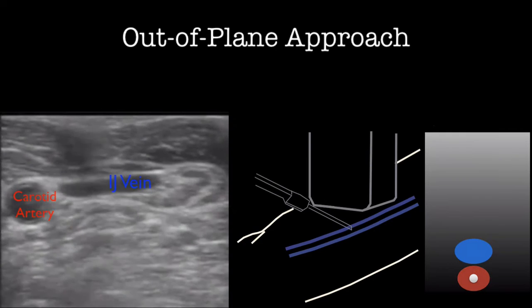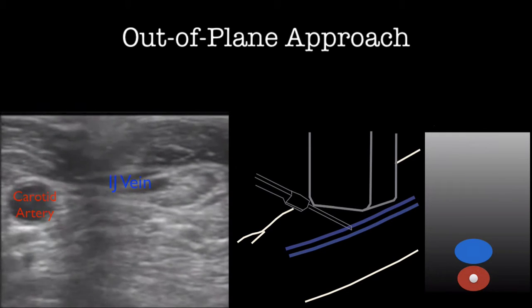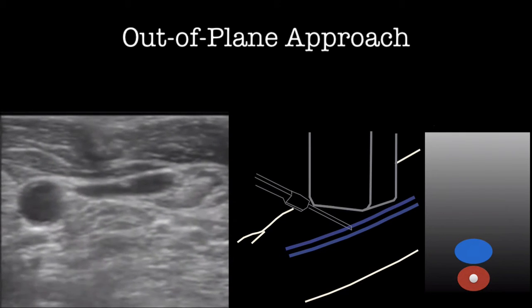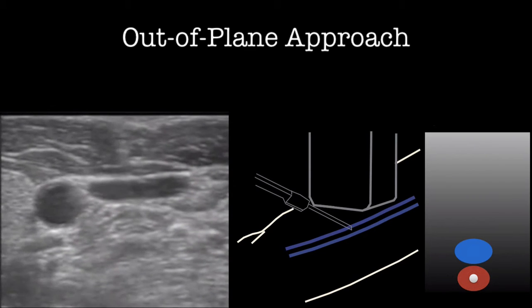Here we see the IJ vein next to the carotid artery. The needle has been inserted all the way to the hub and you cannot see the needle tip as it is deep to the vein.